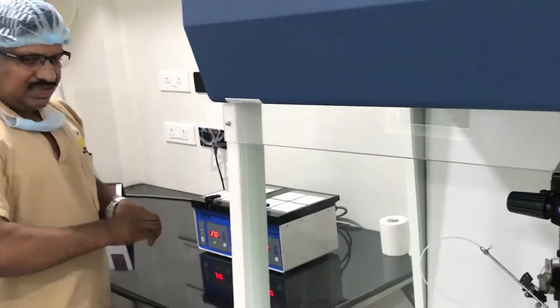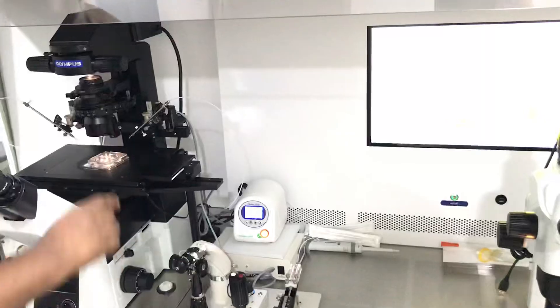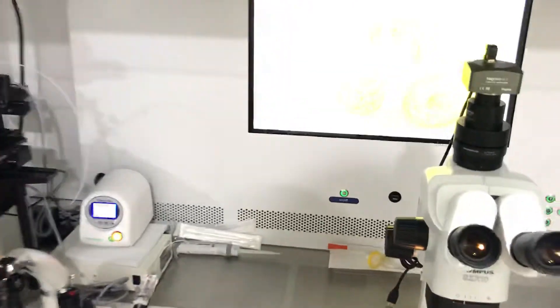This is four hours of culture. This is the last patient - we're about to finish almost all the blastocyst transfers now.